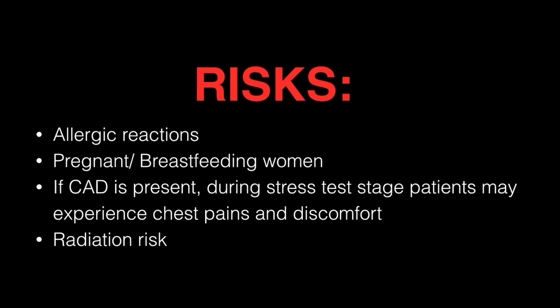There are also risks associated with undergoing a PET scan procedure. These risks include an allergic reaction to the radiopharmaceuticals, however they are very rare and usually mild. Women who are pregnant or breastfeeding should not undergo this type of procedure. If CAD is present during the stress test stage, patients may experience chest pains and discomfort. Due to it only being administered at a small dose, radiation exposure is low, therefore this radiation risk is quite low compared to the potential benefits of the exam.